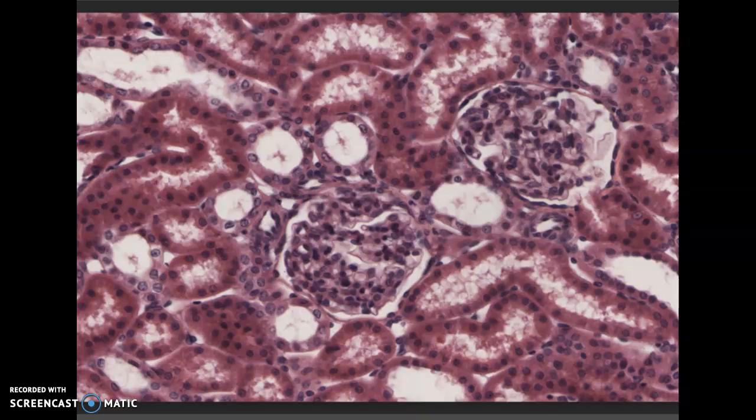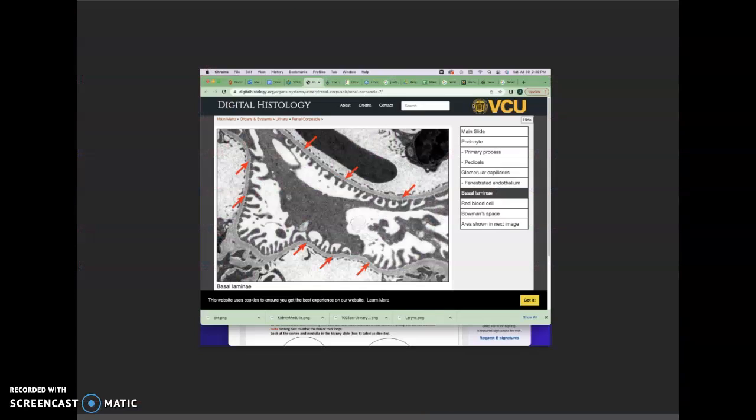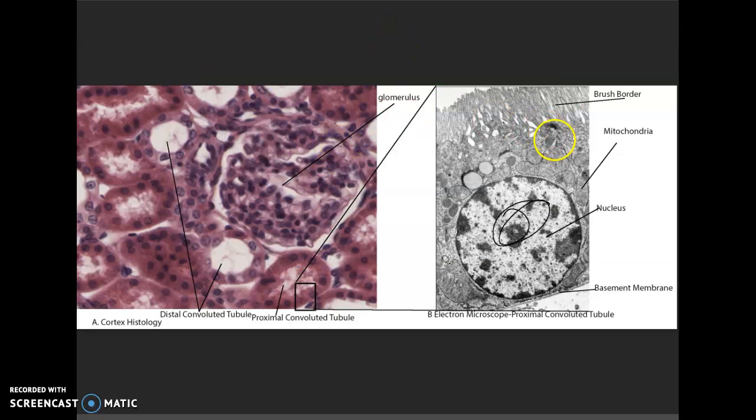In this one, you are going to take this picture. This picture from the web page is from Digital Histology. I gave you the link. I just screenshot it. That's what Jen did, I think, for most of the digital histology. One thing though, when you do the screenshot, see how I accidentally had the red arrows left in there? Don't get the red arrows in there. And you are going to basically make it into one picture, A and B, like this one.